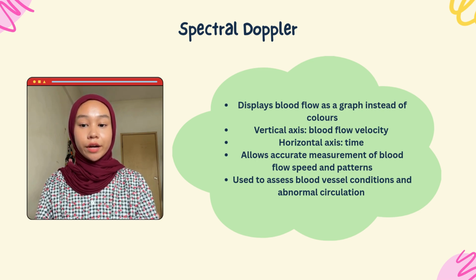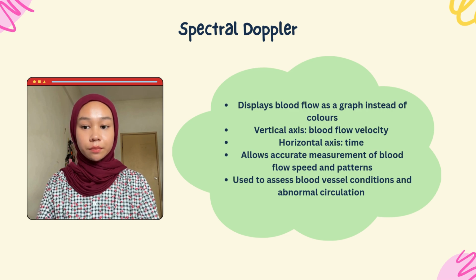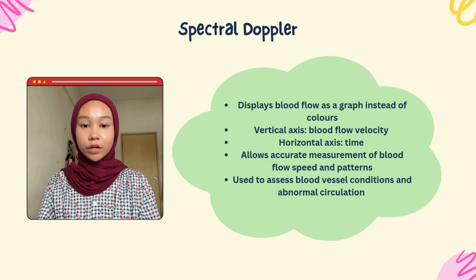Spectral Doppler is very useful because it allows doctors to accurately measure blood flow, speed, and patterns. Doctors can use it to assess conditions like valve problems and abnormal circulation.